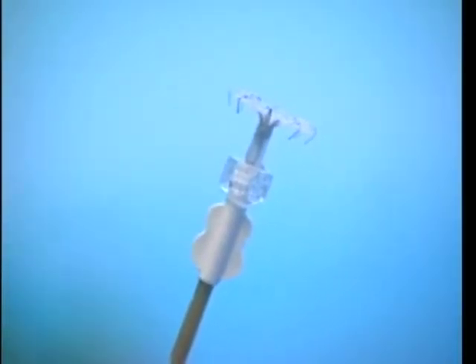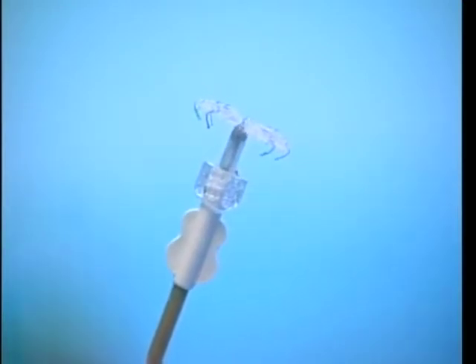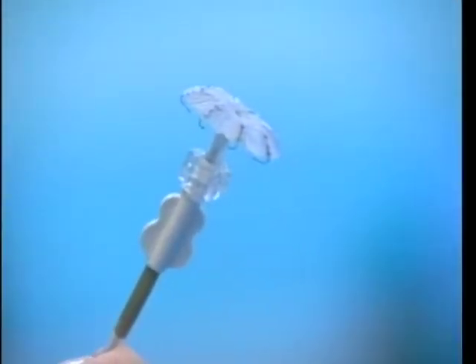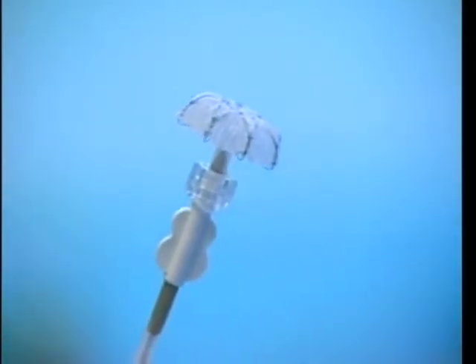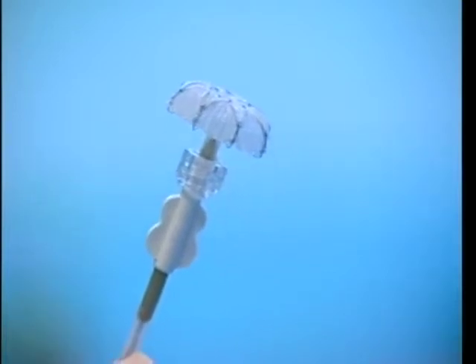Here are now the small hooks, in parallel. And if I push and roll out, the hooks are so small we cannot see them. The big hooks you see, these are not the ones. Okay, good. Very small, 1 millimeter long, right?